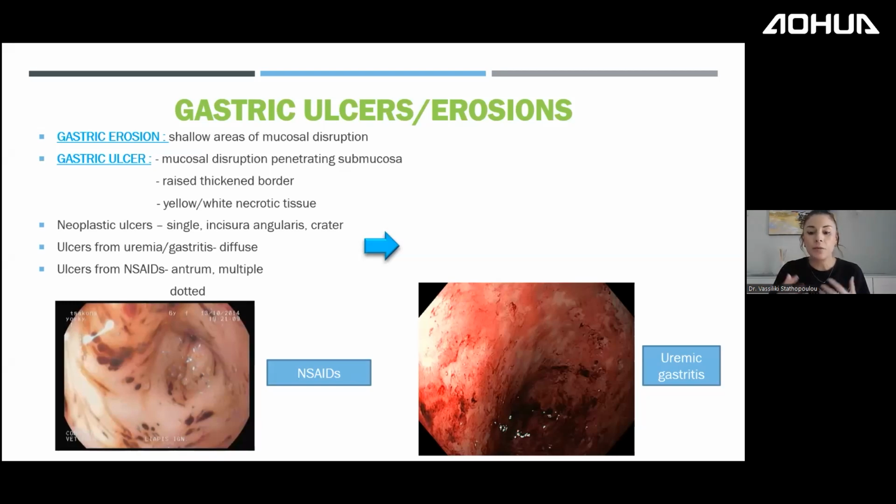Of course, when you're an experienced endoscopist, you always have a first gut feeling if this is neoplastic or not. And you might also combine it with the clinical history of the animal that's admitted, but most of the times your biopsy will give you the results.